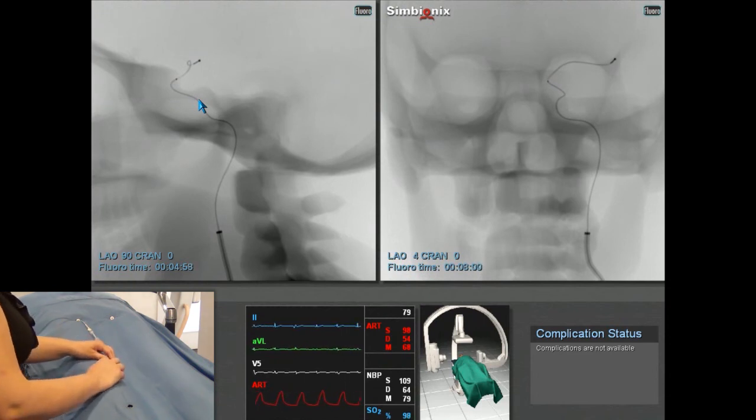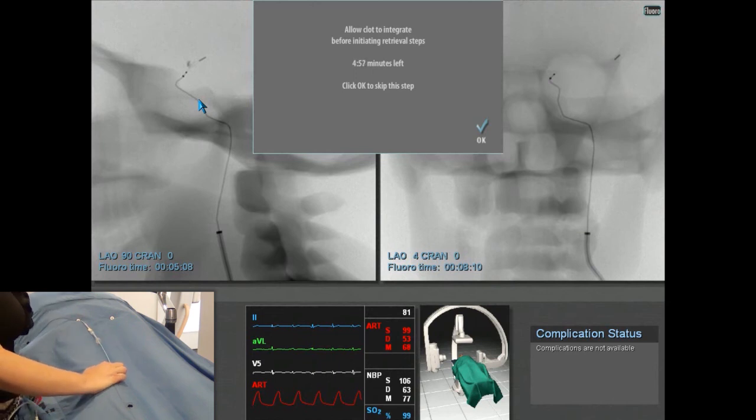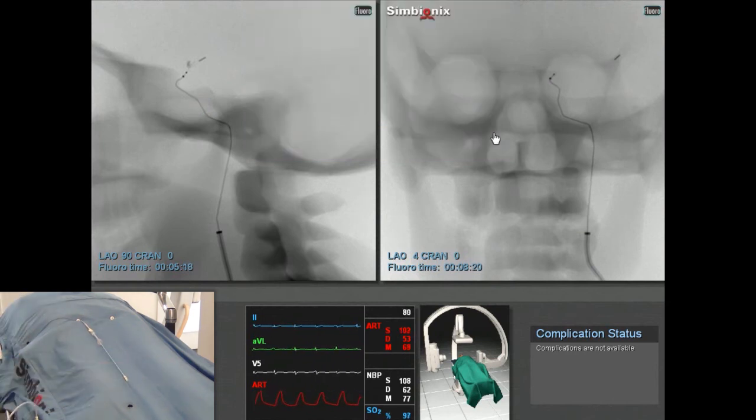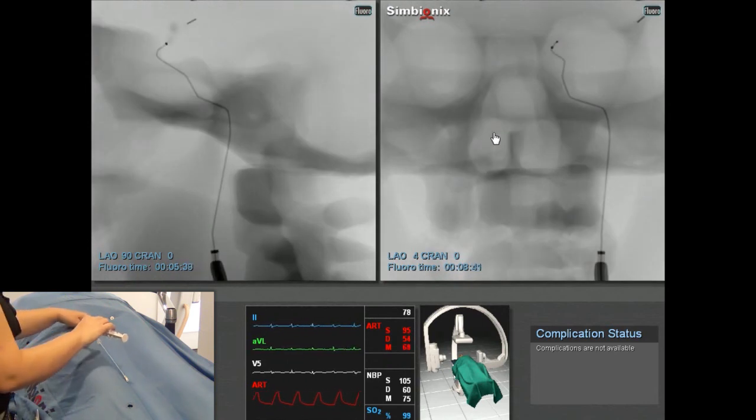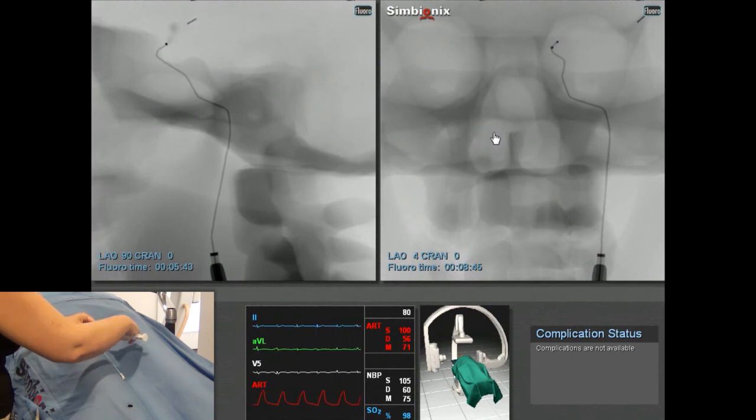You'll see, because it's nitinol, it will self-expand, and you'll see the tines of the stent as you unsheath it. So you can kind of vaguely make it out, and it gets wider. And then a timer starts, because again, these work essentially by engaging the thrombus or letting the thrombus come in through the tines of the stent and then pulling them out as though the thrombus were inside a basket.